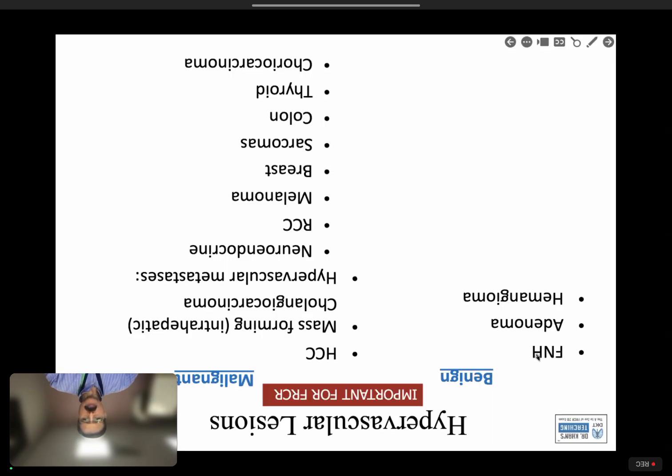Now, there are other concepts which you can use on MR or clinically speaking. Hemangioma, there is a particular type of hemangioma, we call it a flash hemangioma. That will be bright on T2 weighted sequence. It might show restricted diffusion on DWI sequence. And the signal intensity will be equal to blood pool on all phases. So if you look inside the lesion, the signal intensity will be equal to the blood pool, meaning the portal veins and the hepatic veins.